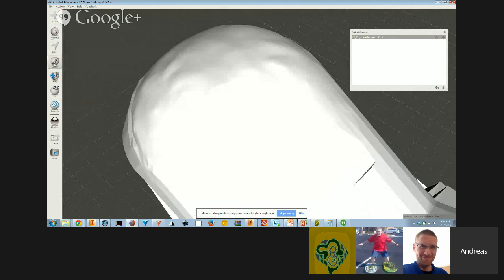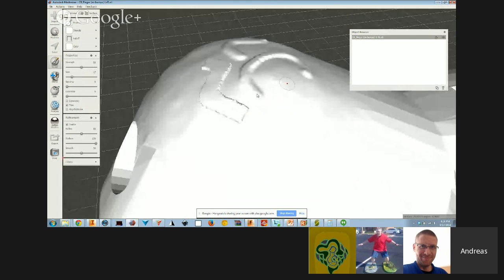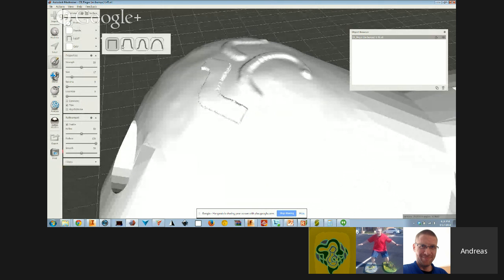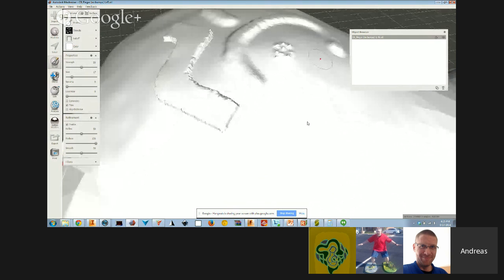So with the Draw Max brush, I can kind of do stuff like this. And you can change the fall off to get different effects, right? So here I have this fall off, and then there's different rounded fall offs. I'm going to keep it on full, and then I'm going to also use a stencil. I can import any black and white image or color image, actually. Black and white's kind of more predictable. So in this case, I can create these little bumps here.